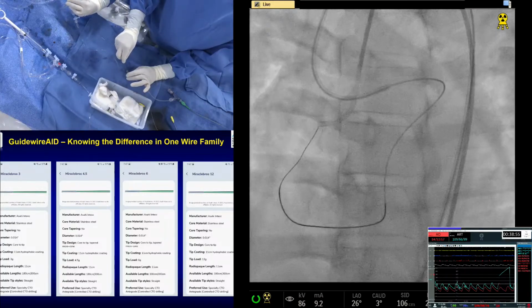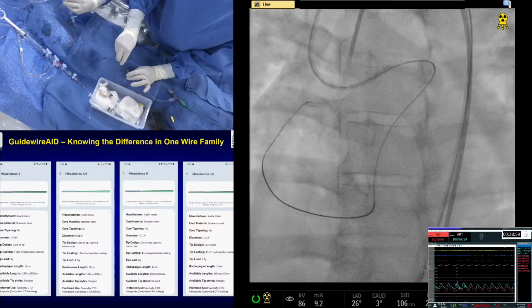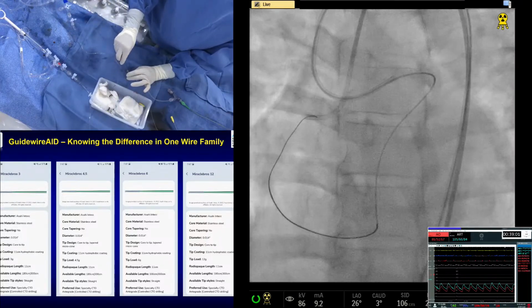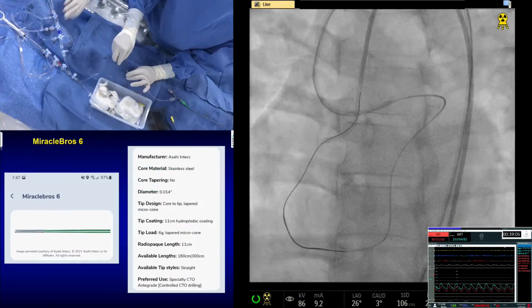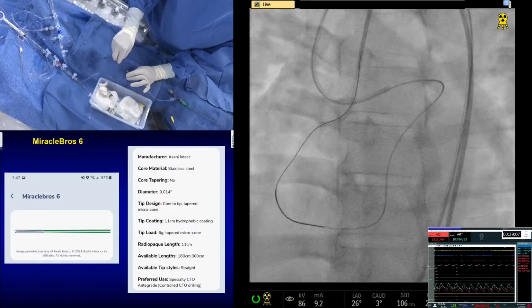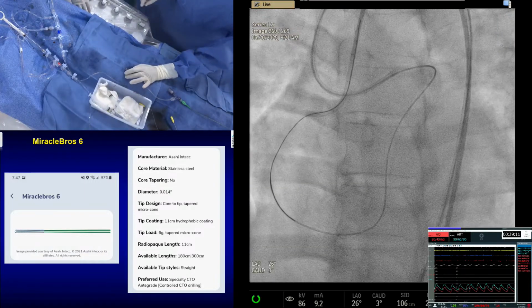So we actually have one room, which is room 1, which is 10, 11 years old. That was the best one at that time. Their radiation is almost 2.5 times for the same time period and the same people doing it. Okay, good. But things have changed in the meantime.